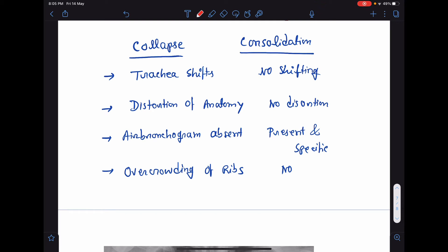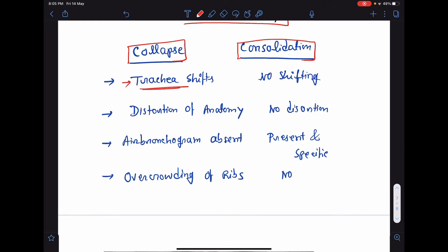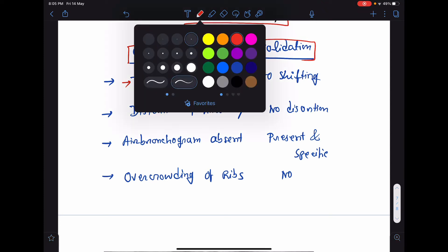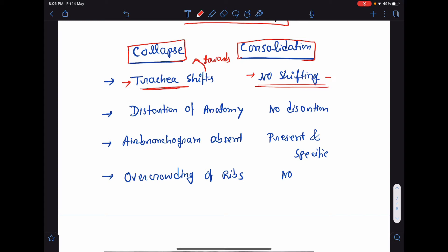Now, let's see how we differentiate lung collapse and consolidation, because both will look white in chest x-ray. In collapse, there will be tracheal shift. Most of the time, in case of collapse, the trachea will shift towards the site of collapse. But in consolidation, there is no shifting, because there is no pulling or pushing force. So, trachea will remain in the midline.